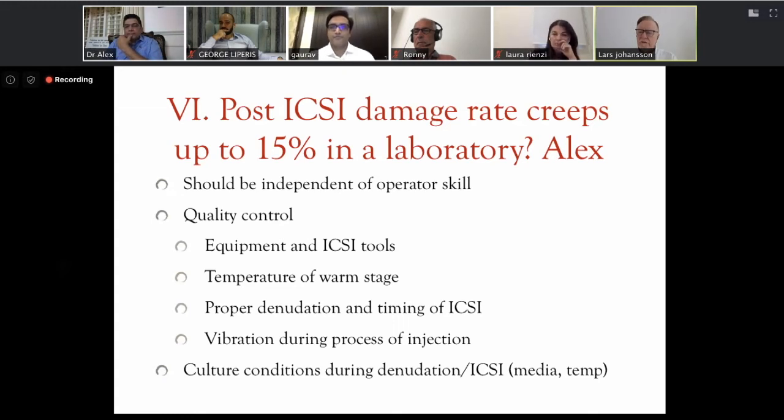It doesn't work. The other thing I just wanted to mention is aggressive denudation, too quick denudation. You might have oocytes, but when you inject them, you have like a flat tire, and then when you push in the next, it goes lysing. That is aggressive denudation, I feel. And also the wrong pipettes, when they are not slim all the way, then you also push in a lot of pressure inside the egg.